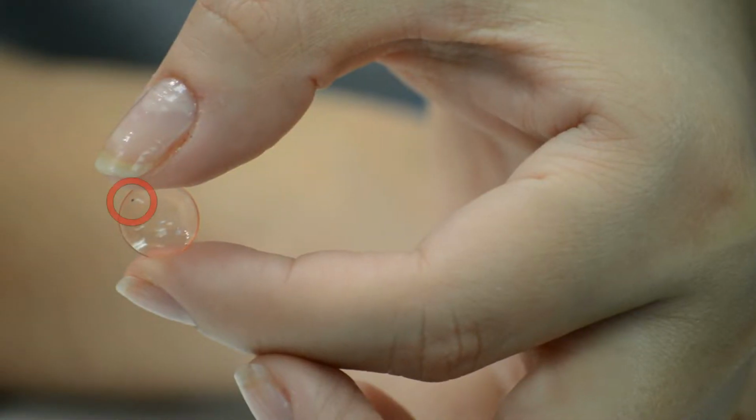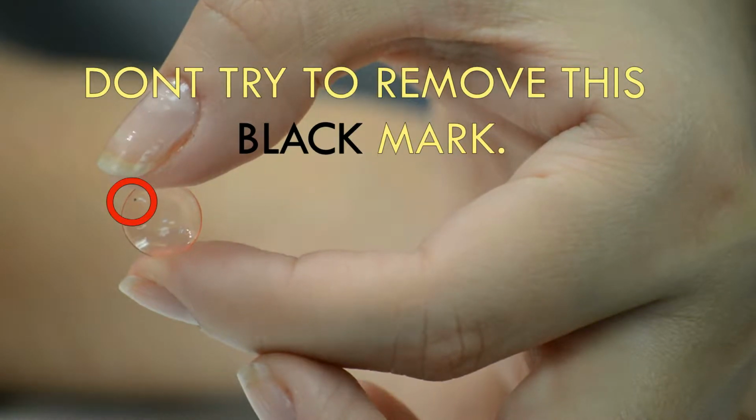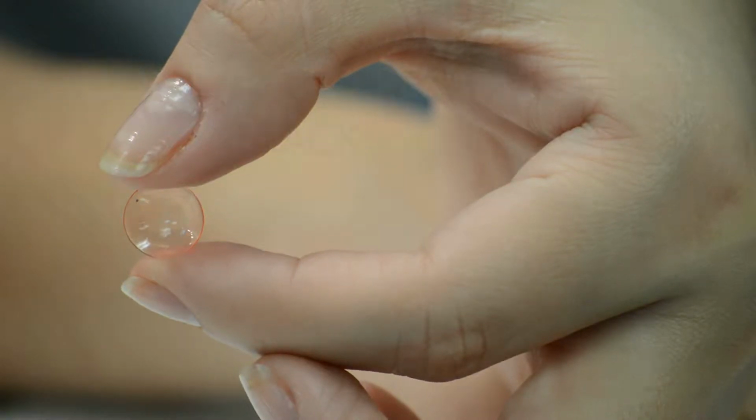You will notice a black dot on the right Ortho-K lens. Don't worry, your lens is not dirty, so don't try to remove it. This mark was placed in your lens so that you might distinguish right from left in case you're unable to see the lens color.